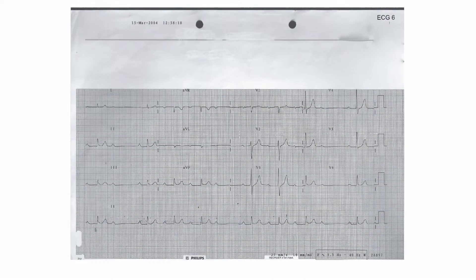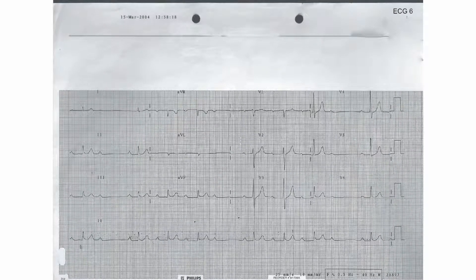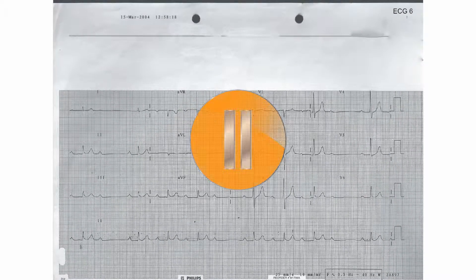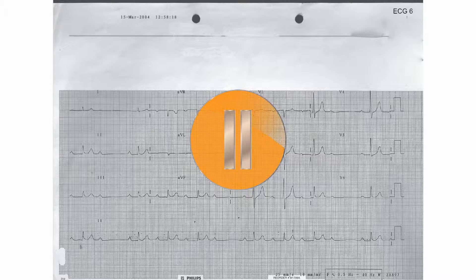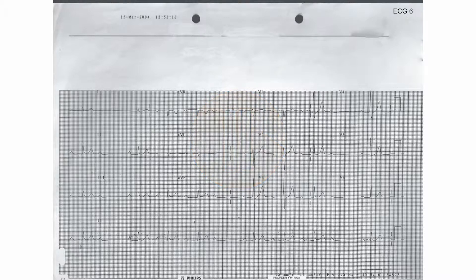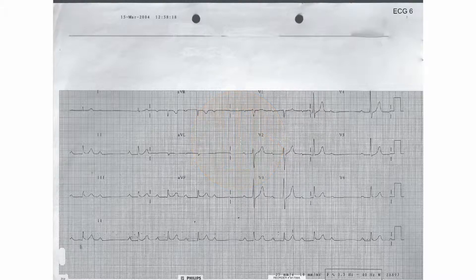This is the ECG of a patient who came to hospital with a collapse. Pause this recording now and interpret the ECG on your own, before pressing play again to hear me interpret the ECG.